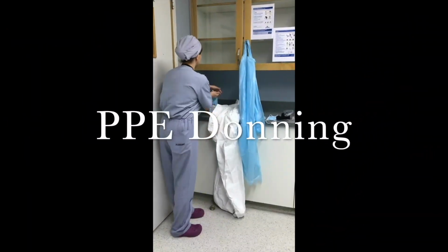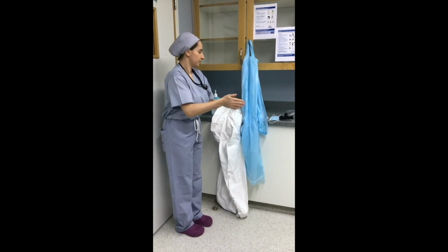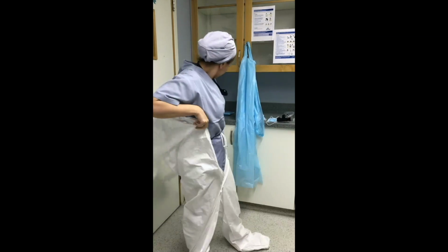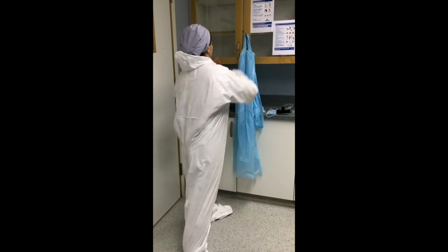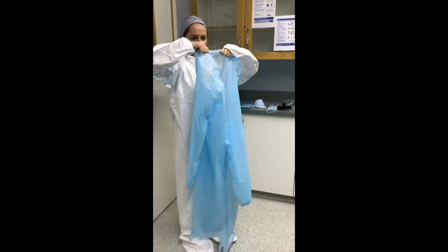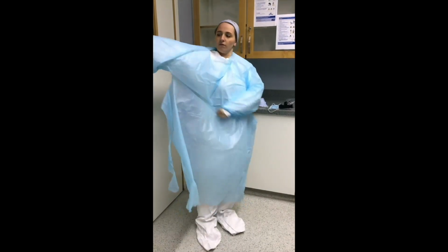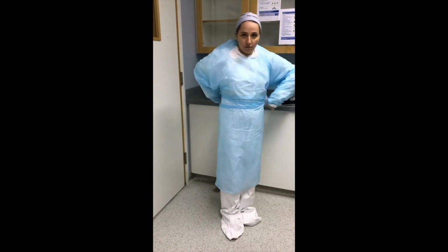Start by washing your hands with an alcohol-based solution. Next, wear your Tyvek suit, followed by the blue impermeable gown. Tie it in a way that you can untie it at the end.